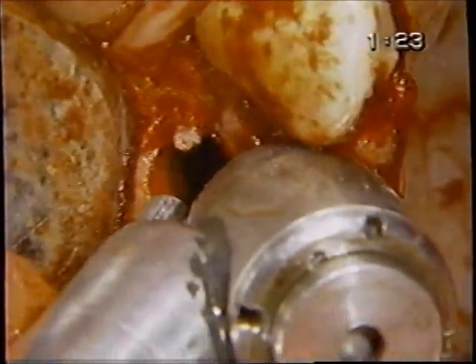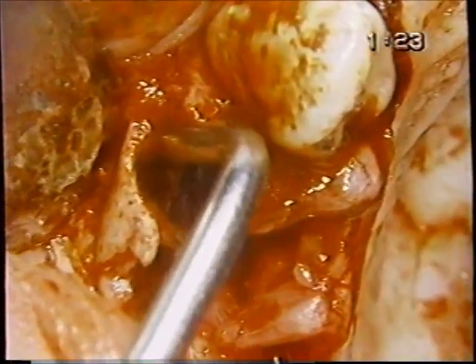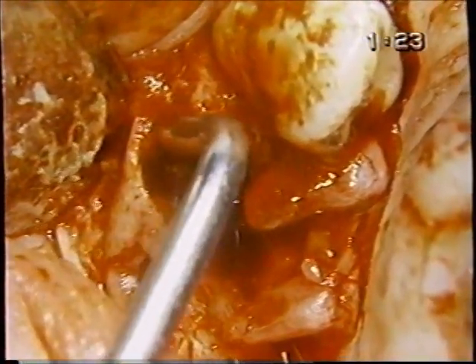Again, get my bearings. Here's the base. I don't want to go any farther than that, nor do I want to go lingually. Okay, what's happening here is using the back side of this, fulcruming a little bit against the socket, we've lost just a little bit of bone there. That's okay. Since that happened, let's remove it. One thing about it, it should greatly enhance our visibility.